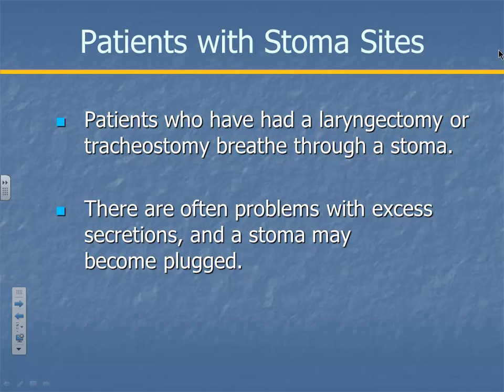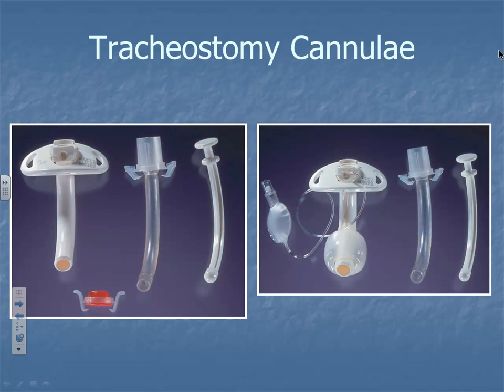Okay, we already talked about this. These are just some of the cannulas that they'll use for a tracheostomy. This is a Shiley. That's what we were talking about if you have to do a surgical airway. These two go together. This is like the stylet here. Same thing here. So your patient may very likely already have one of these in place that he's breathing through. Or if it's somebody that's, say, hospitalized and they have one of these in place, you just bag over that.